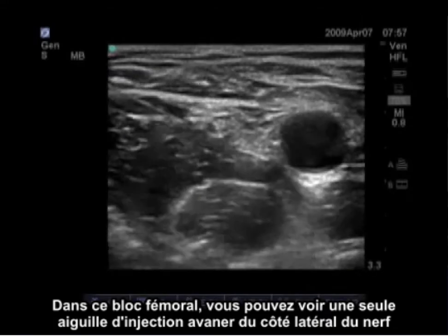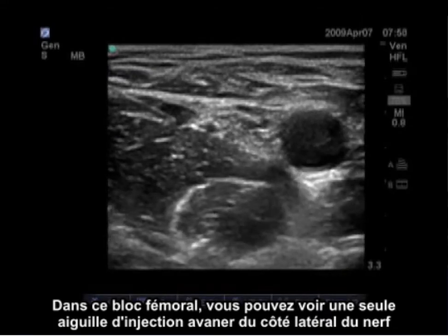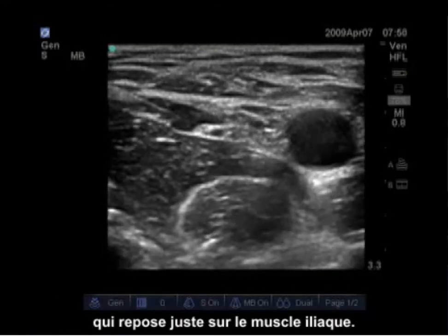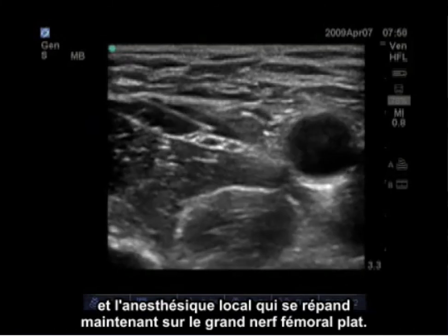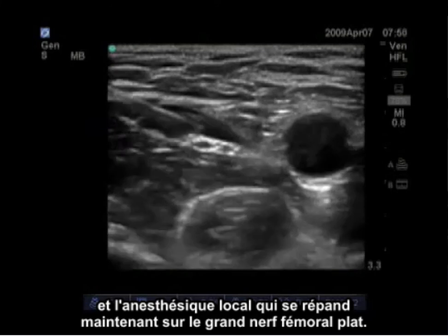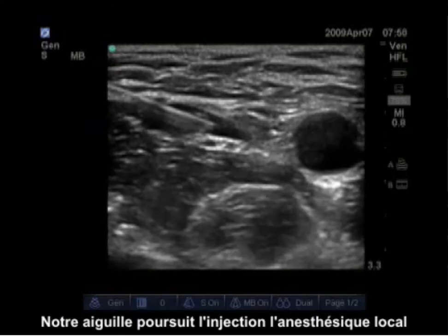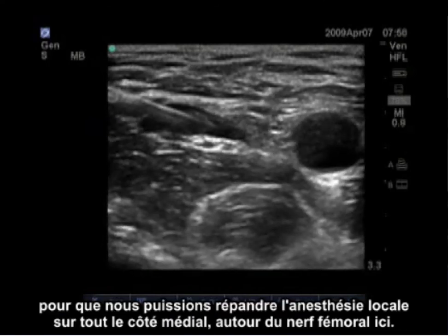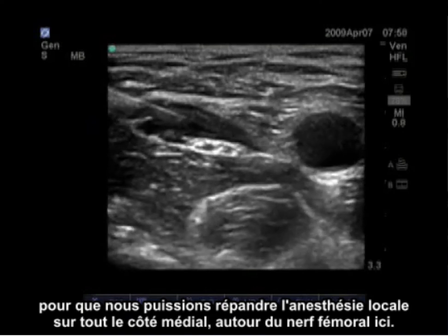In this femoral nerve block, you can see a single injection needle being advanced lateral to the nerve, which is lying right on the iliacus muscle. You can see the pulsating femoral artery medially and the local anesthetic spreading over the wide flat femoral nerve. The needle tracks in with the local anesthetic so we can get local anesthetic spreading all the way medially around the femoral nerve.